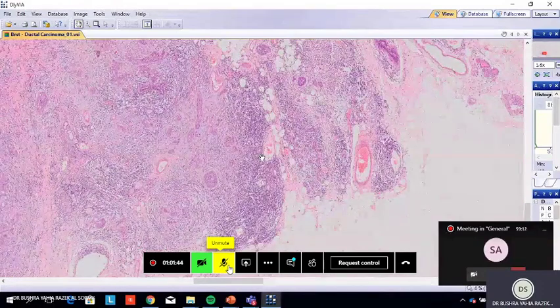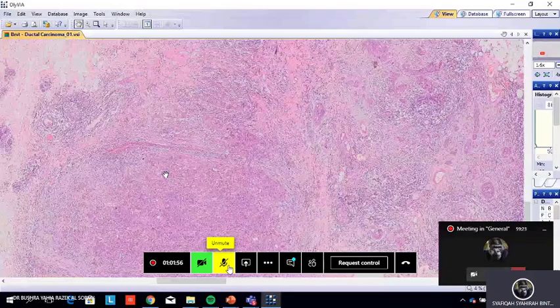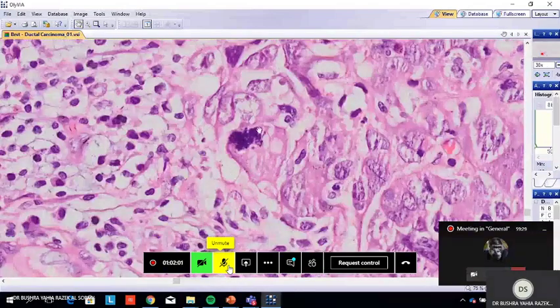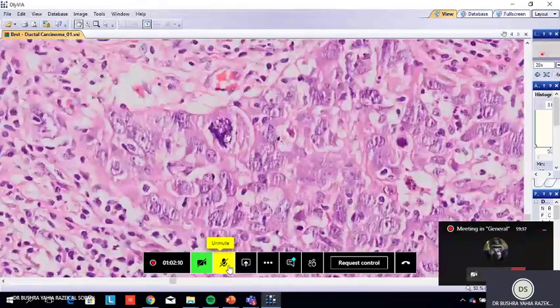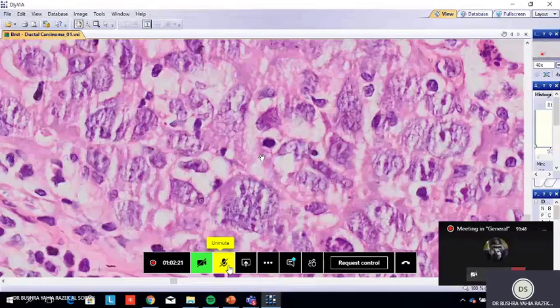Clear? Doctor, I want to ask, how do you know if that is mitosis? Because sometimes I can't recognize if that is mitosis or not. Look, this one is mitosis. See? This is mitosis also. Here, mitosis. Can you see abnormal mitosis? This is also abnormal mitosis. Here, abnormal mitosis. This one, for me, I cannot consider it not mitosis.